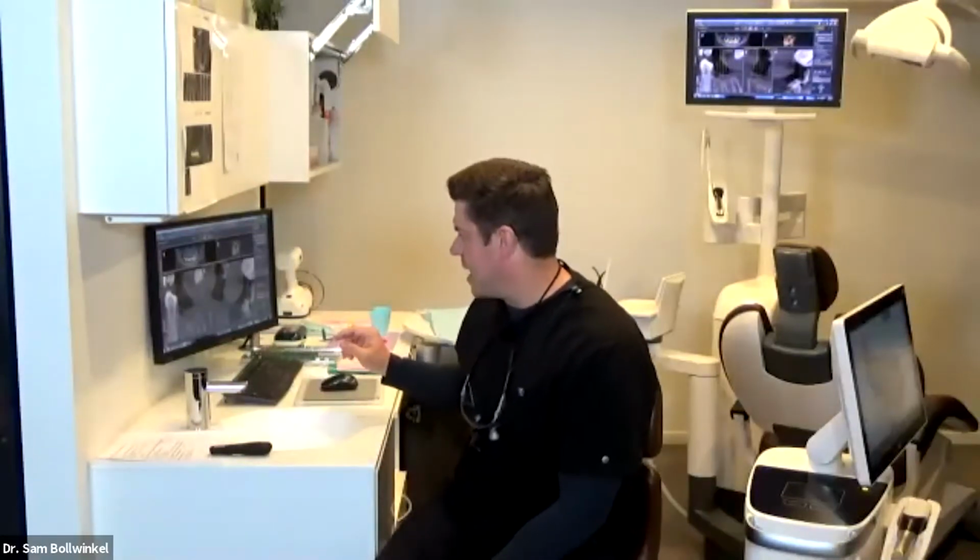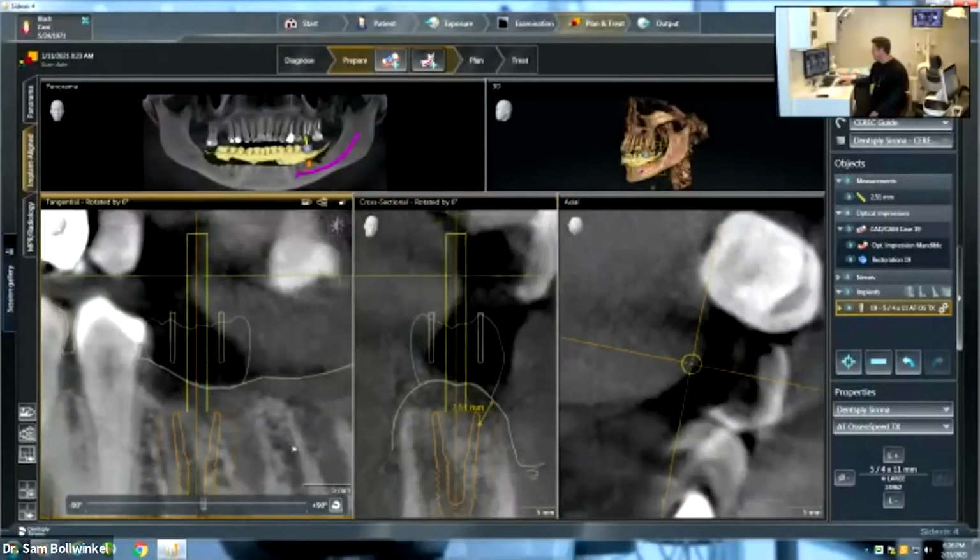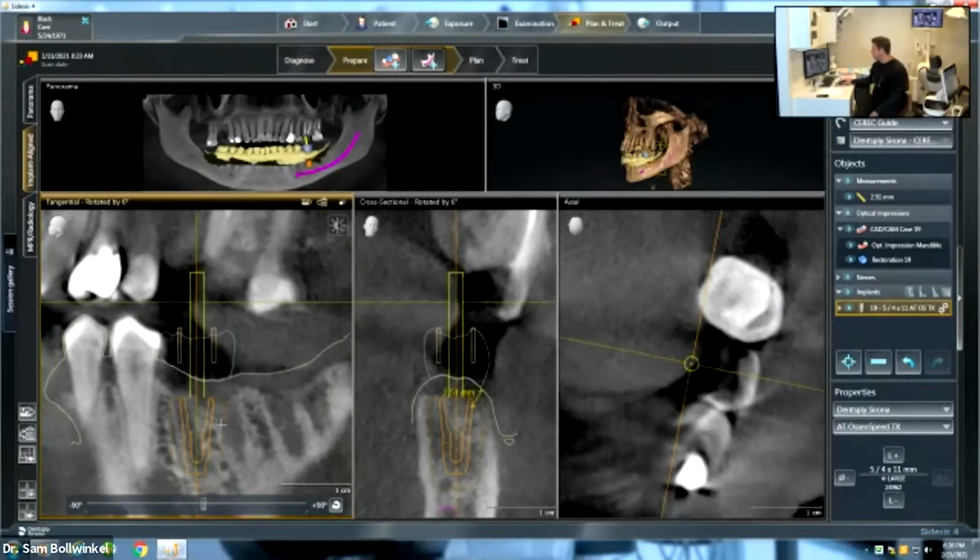We know that restoration now is going to have absolutely no convergent or emergent profile. We have no ability to push tissue then into the embrasure space. And so it's going to be that orange on a toothpick. You're going to have a little narrow sleeve where the custom abutment comes up, and then the tooth's going to just sit right on top of the tissue. And you've got this massive food trap, hygiene trying for the patient to keep it clean, let alone for professionals to have them come back every 4 months, 6 months to keep it clean. It's a disaster.